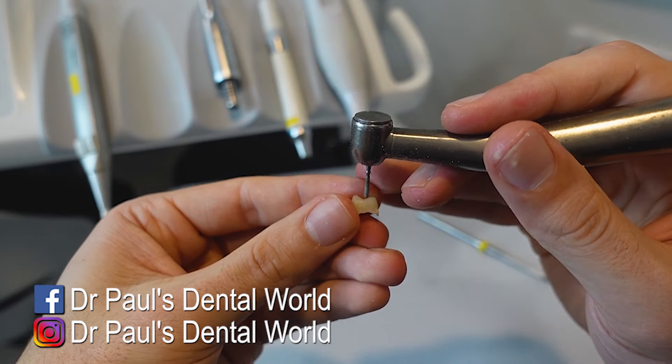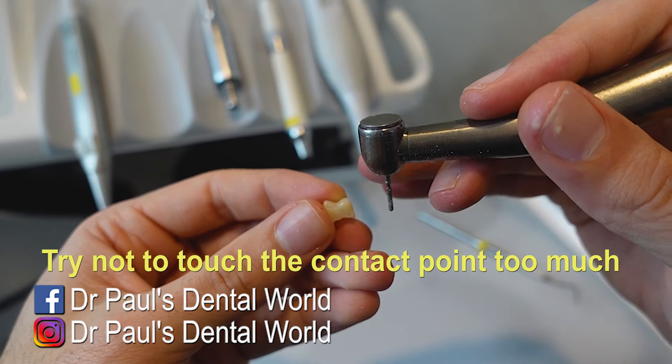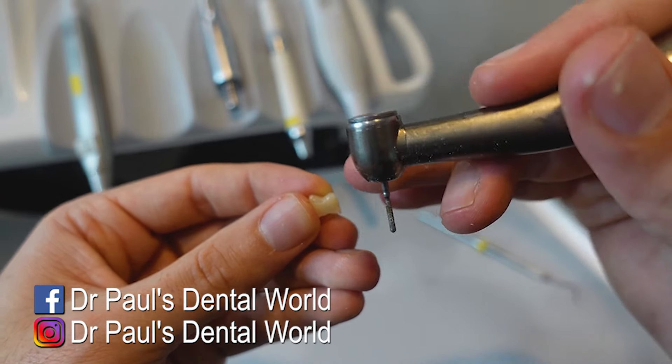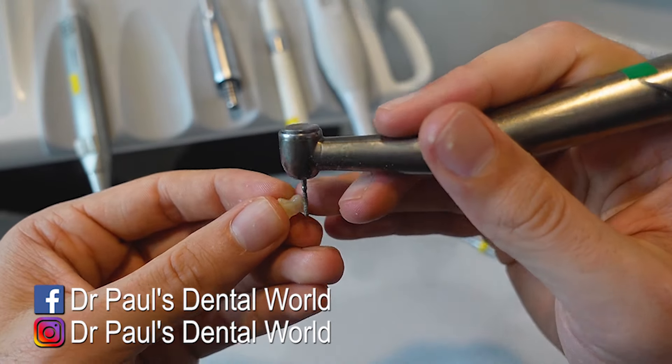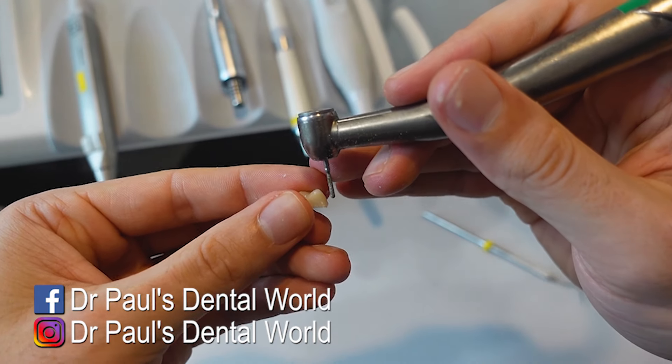So you'll get your high speed and you'll go around and remove those little bits. Make sure as well that you don't take too much here. Because if you do, you can affect the contact between this and the next door tooth. And if you remove that contact, this tooth can now move measurably, and then your final crown won't fit.